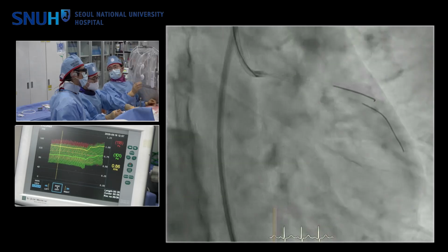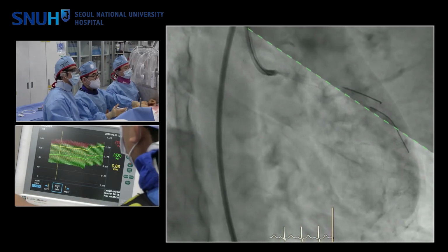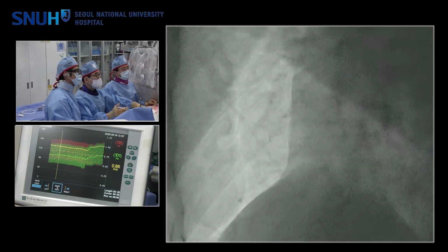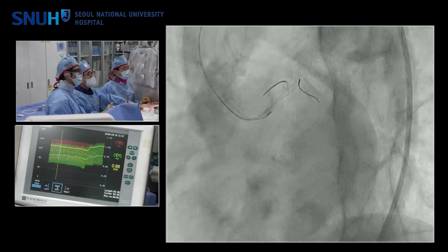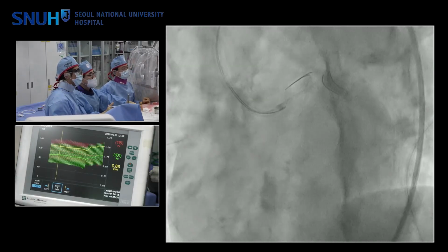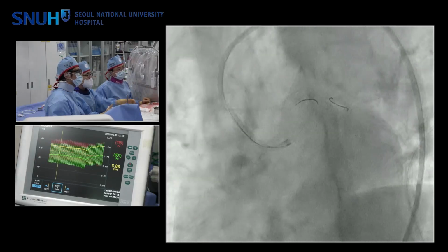Okay. 스파이더 뷰. 저 이미지 가서 VFR 계산해보고. 좋네요, 그죠? 살짝 테스트 해볼게. 괜찮나? Okay. Yeah. 오케이. Snap, ready? Please.